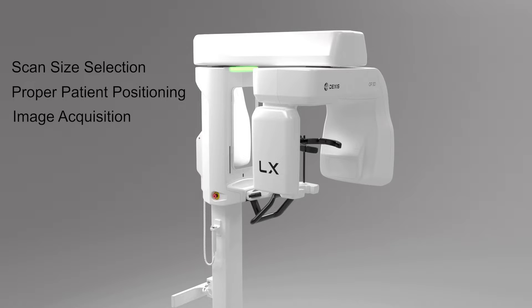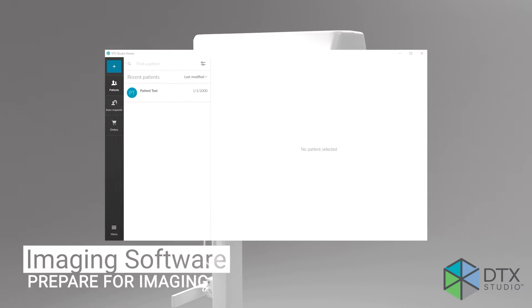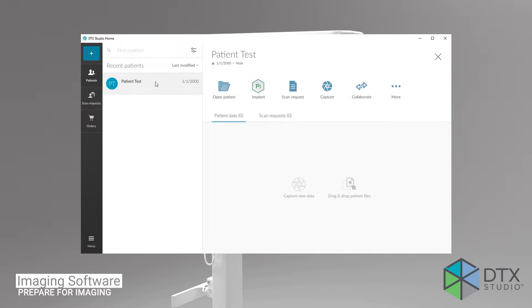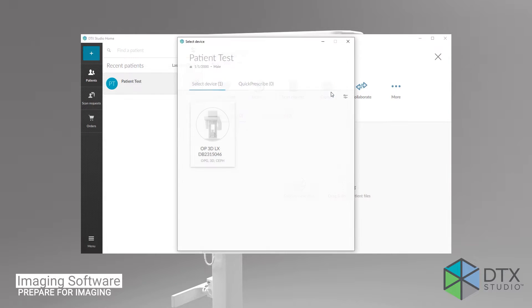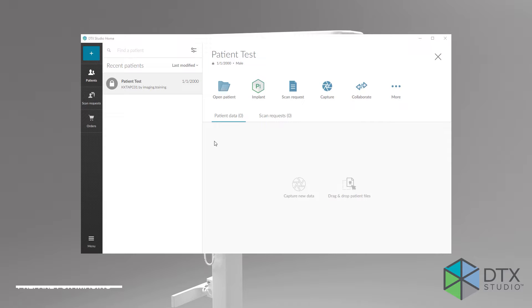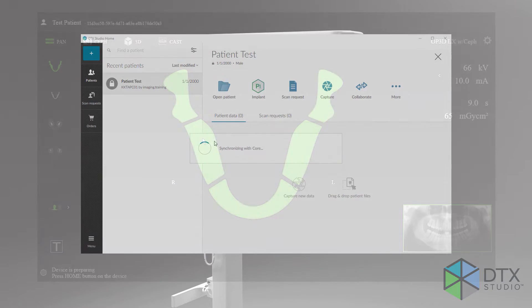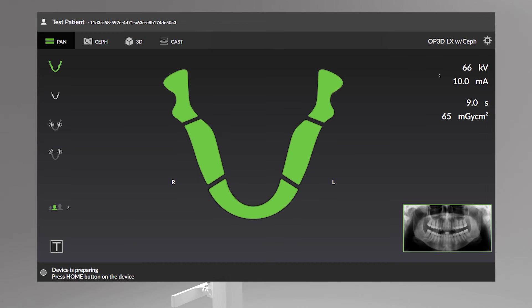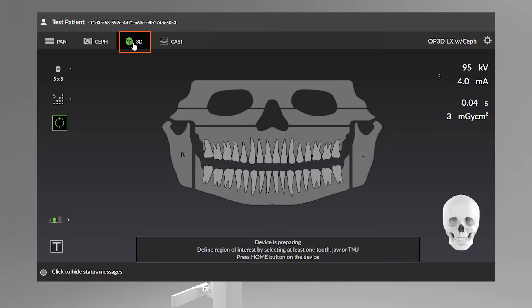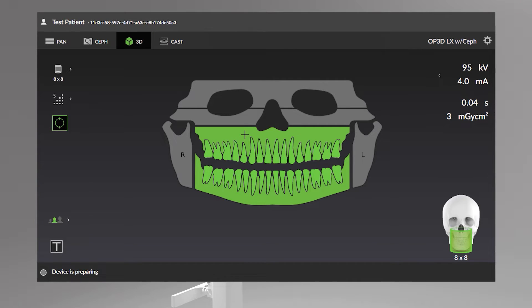Start by opening your dental imaging software. Select the patient for examination and select the device to establish a connection. The OP3D LX graphical user interface opens on the workstation when the connection to the device has been established. Select the 3D modality. With the 3D imaging program selected, you can select the region of interest on the dental chart for the 3D scan. This will automatically change the field of view according to your selection.